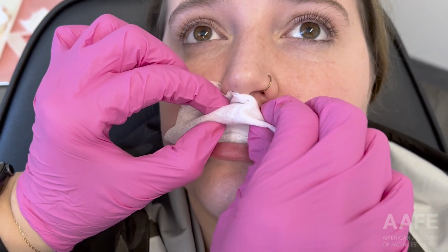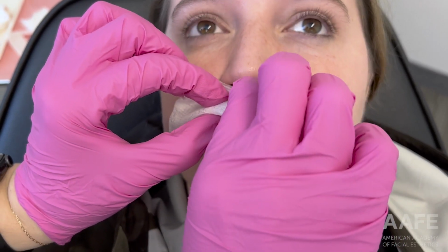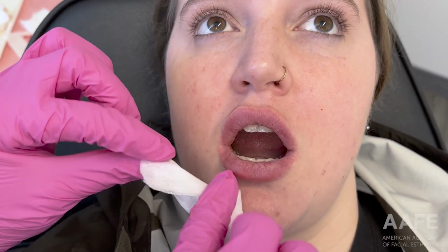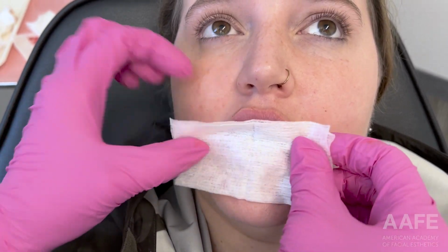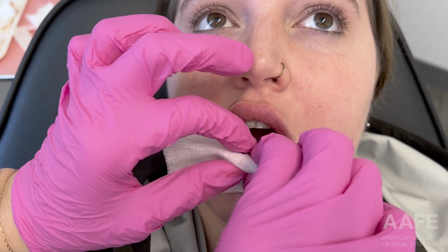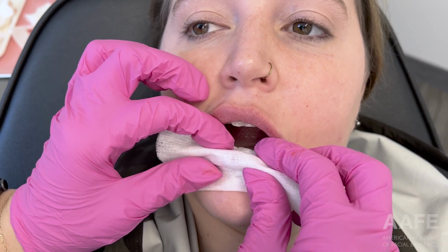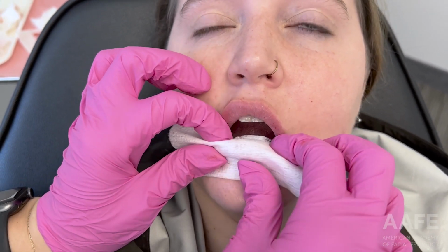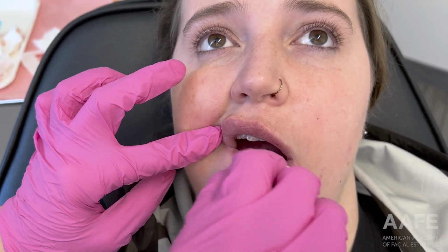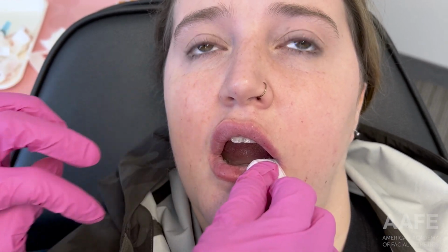I'm just manipulating that product slightly, working out any of those little bumps that I feel, and it feels great. Down here, right in the middle where I laid a little bit more product, I do feel some firm product that I want to work out slightly, but just very gentle pressure. Doesn't hurt, correct? Good. I'm going to hold a little bit of pressure there. This patient is a little swollen, but not terrible at all.